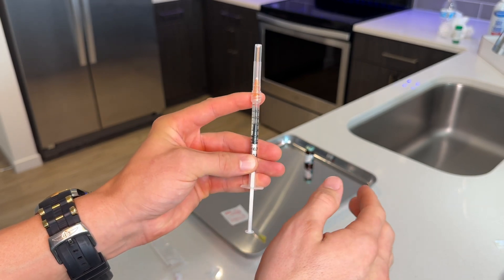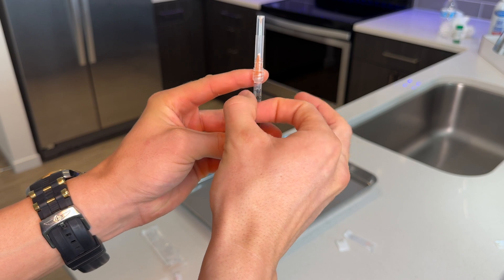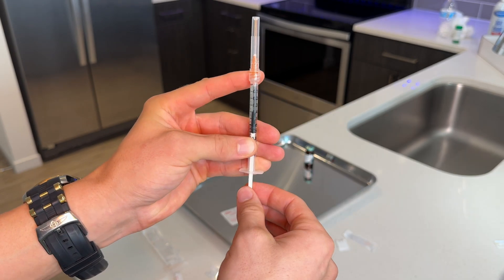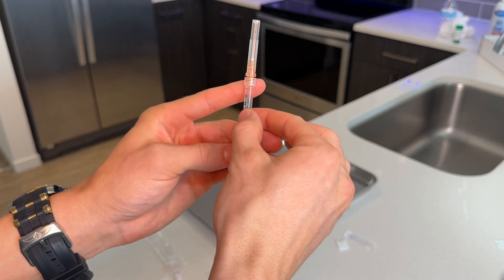If there are bubbles, it's easy to fix. Drop back on the liquid, give the top a couple of flicks, and this usually pops the bubbles. Then you can press the liquid back into the needle, squirt a little bit out the top, and you are ready to go.